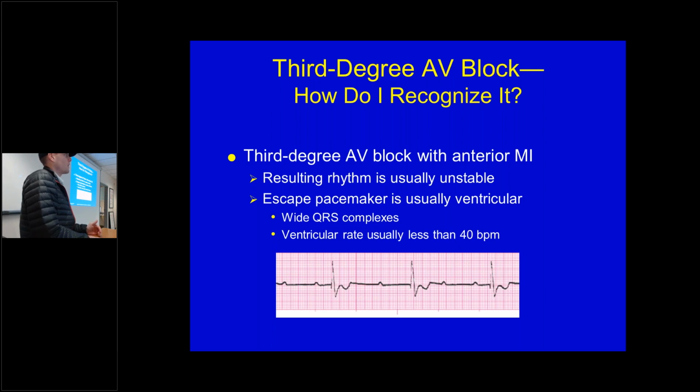That's why it's bradycardic, because the ventricular automaticity is slow, right? Does that make sense? Yeah, I thought I read somewhere that it was no QRS. No, if you had a third degree AV block with no QRS complexes, what's that? Yeah, that's asystole. That looks really clean to be a ventricular beat, though.